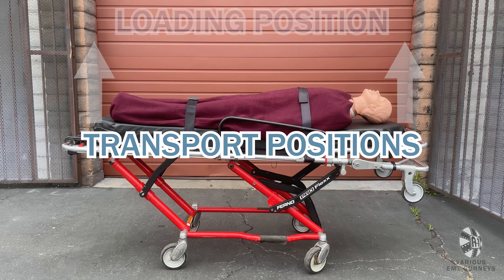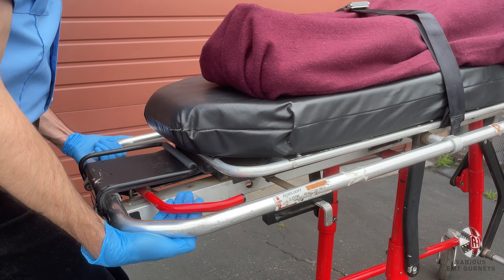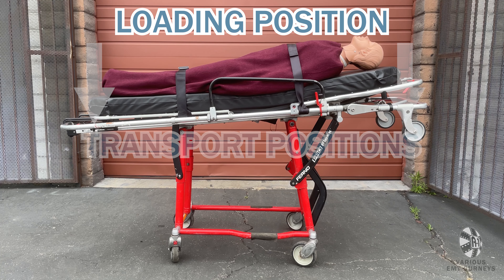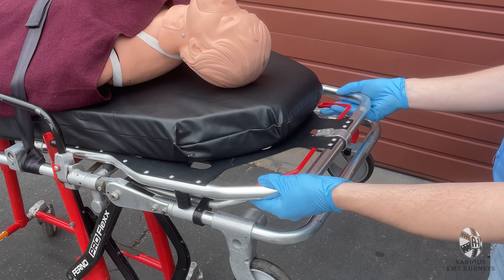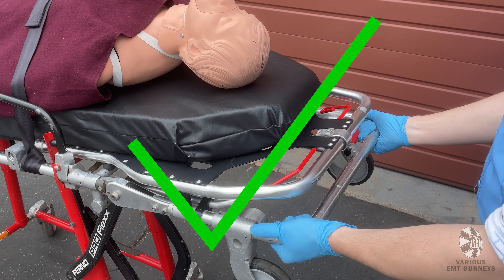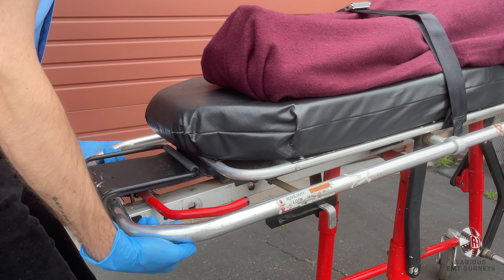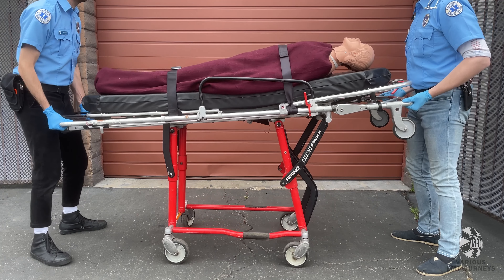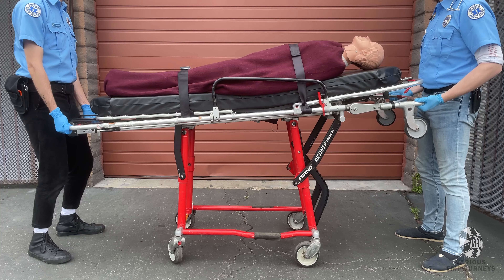If you are in one of the three transport positions and you are trying to get to the loading position, you will need two people. Both people will lift slightly and pull the release levers on both ends. Let go of the levers once the undercarriage is fully extended. To switch to one of the transport positions from the loading position, two people will grab the frame with an underhand grip, making sure not to grab the footrest or backrest. Make sure the auxiliary lock is disengaged. Lift slightly on the frame, then pull the release levers at both ends, letting go at either the low or middle transport positions. If you want to switch to the highest transport position, follow the same steps except you only need to pull the release lever at the head end of the gurney.